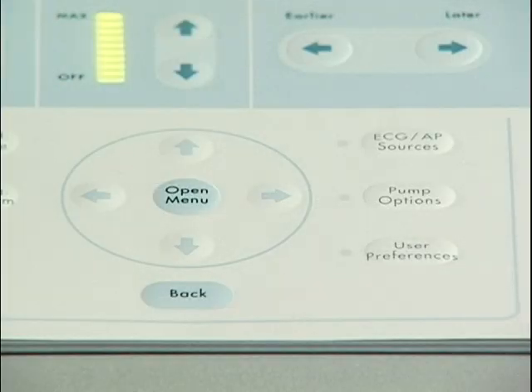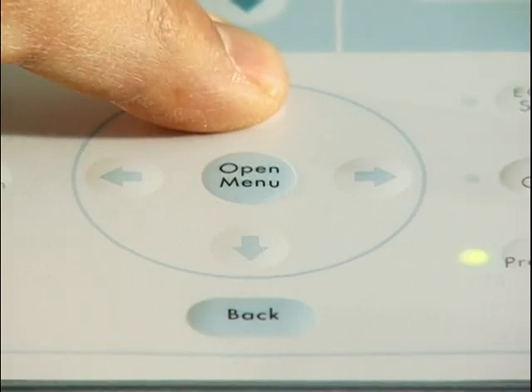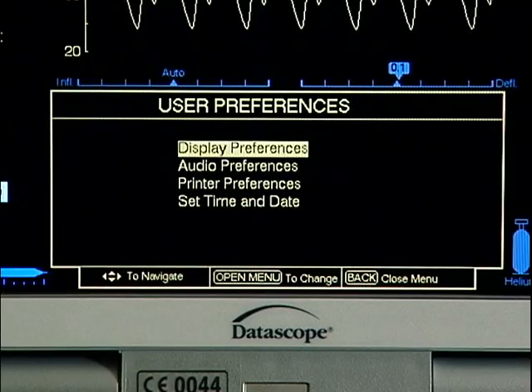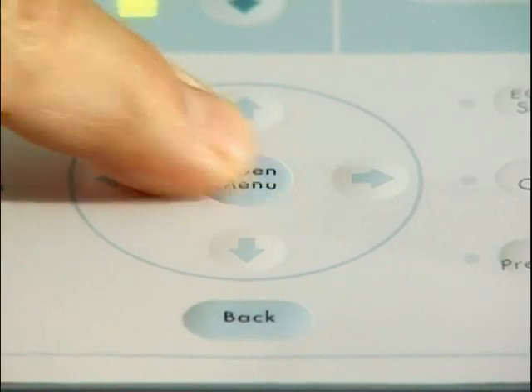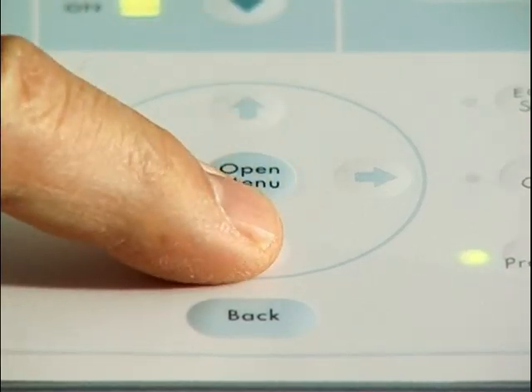The menu guide opens a choice window with a movable highlight bar that acts as a cursor. The arrow keys in the menu navigation circle control the movement of the highlighted bar. Open the desired menu by moving the highlighted bar to the menu desired. Then, press the key associated with that menu. To select an alternative item, use the up and down arrow keys.